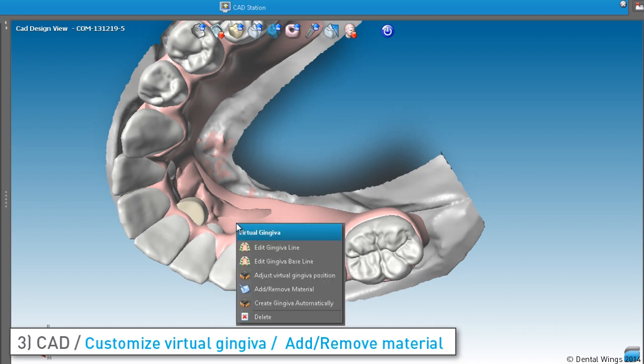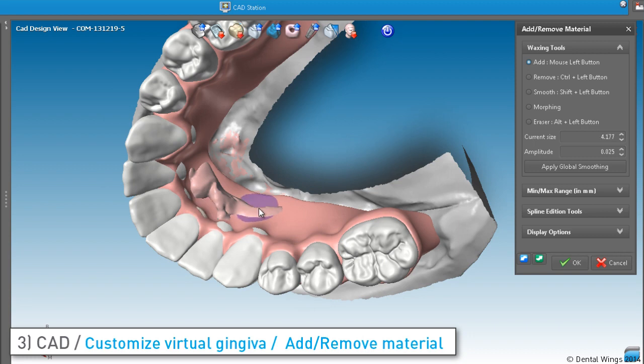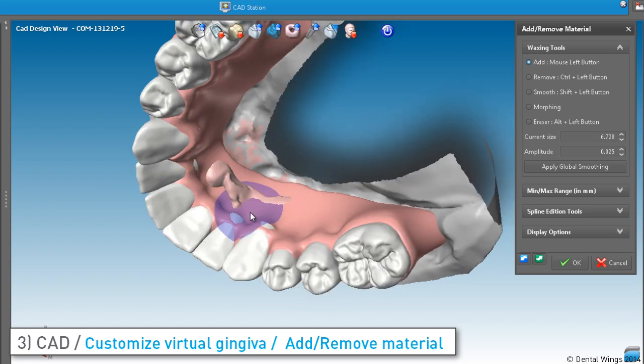The virtual gingiva is recomputed based on the line that you have defined. You can even use the Add-Remove Material tool, which allows you full control over the design. Add, Remove, Smooth, and Morph — use them in the same way as with anatomies.